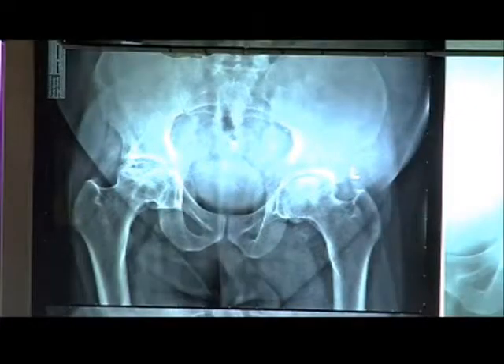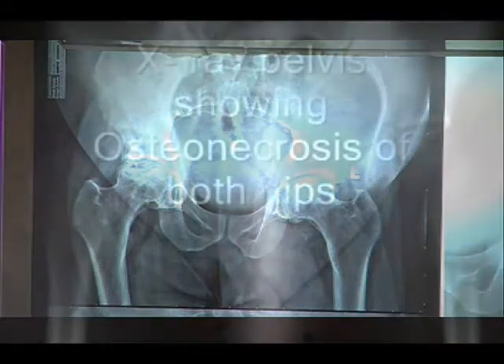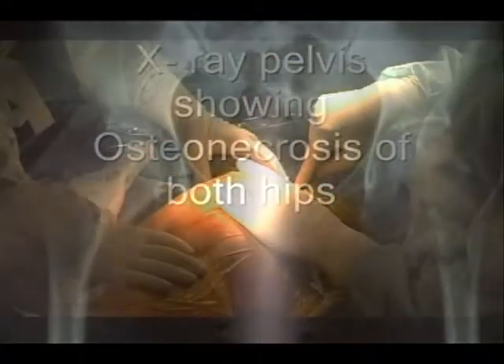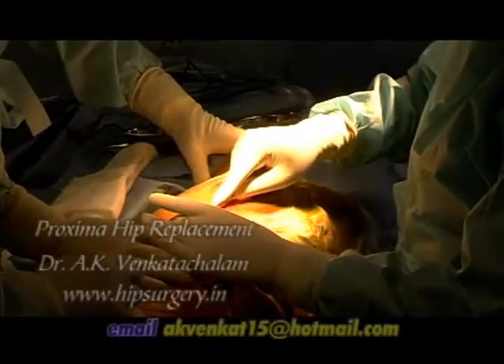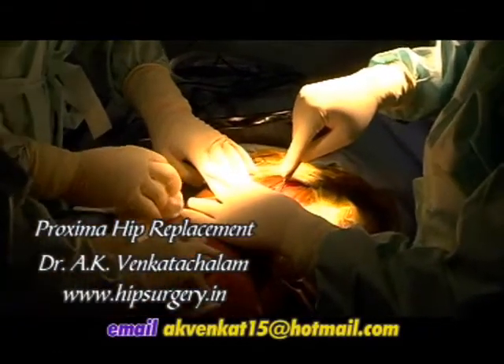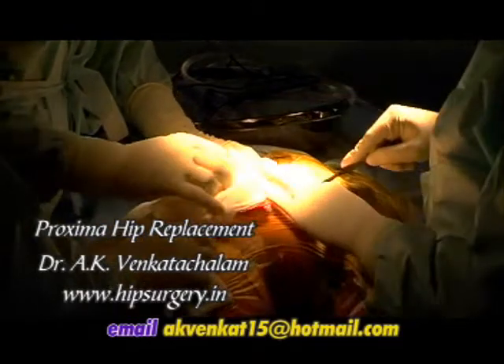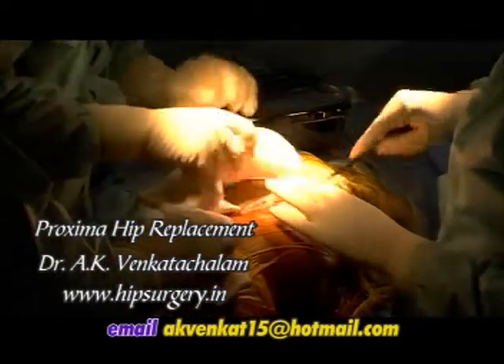This is a 36 year old male patient with bilateral avascular necrosis. Pre-operative templating should be carried out to confirm femoral and acetabular sizing. There is advanced osteonecrosis involving greater than 50% of the head.